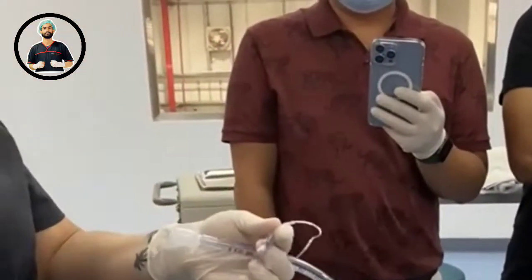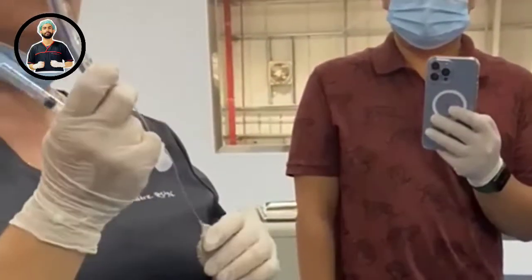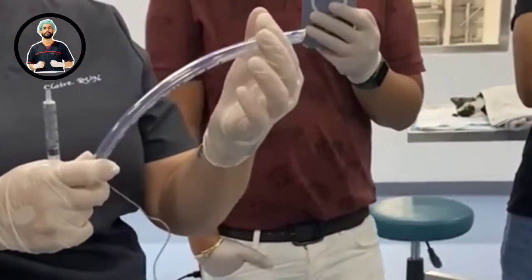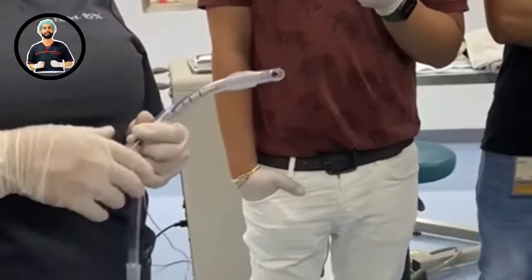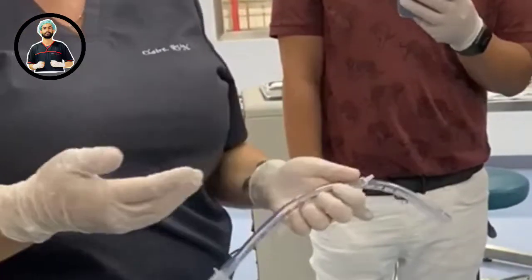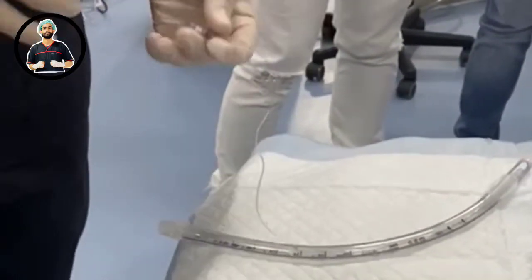Usually use a 5 ml syringe with these bigger tubes. I've sucked all the air out — plunger to the top and pull as much air out as possible. You can see it's gone in nicely and shrunk up. That's how it should be when you intubate — you don't want any air in the cuff at all. If it's slightly inflated, you could damage the tissue going down, especially in cats who are super sensitive and can have laryngeal spasm really easily. The golden rule is: deflate it before you insert.